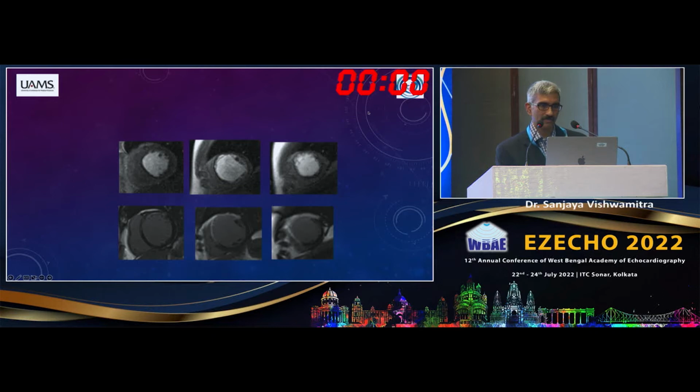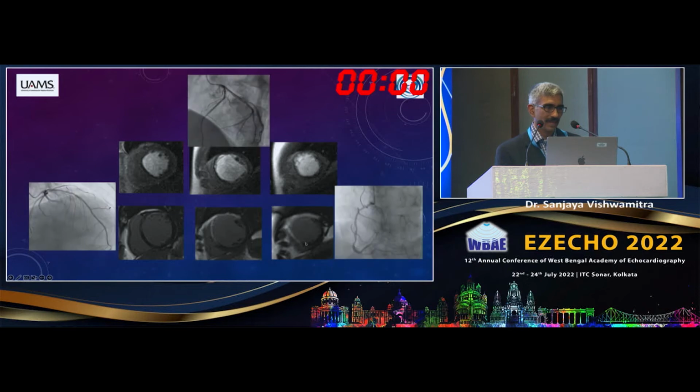What about this type of patient that we see here, which clearly has an infarct, right? You can see the delayed enhancement showing a large area of delayed enhancement. And the coronary arteries are abnormal, but surprisingly not more than 50%. So where does that leave us when you see something like this?